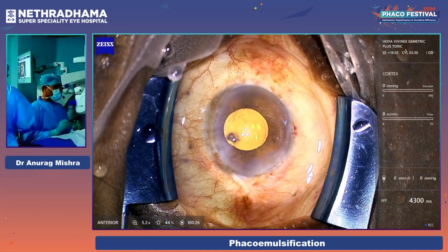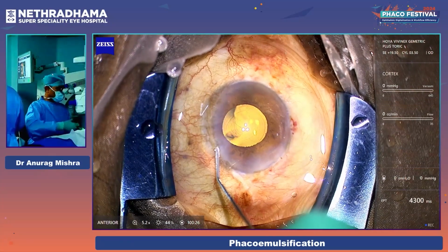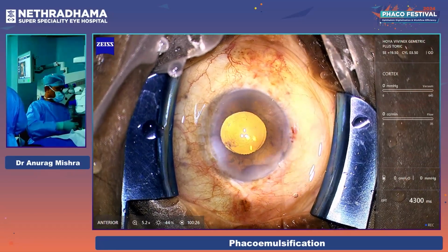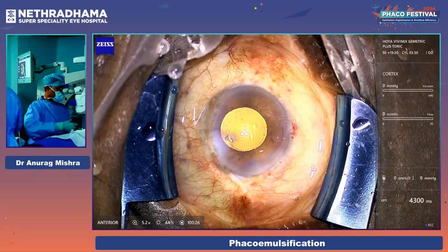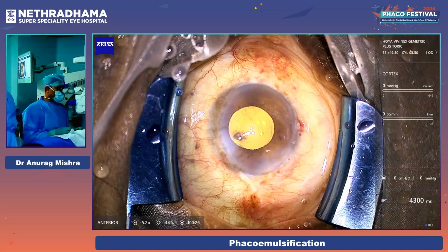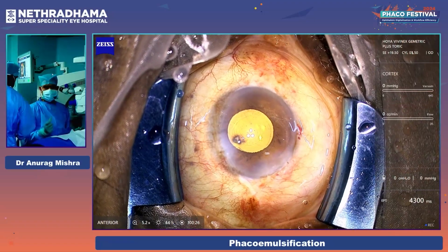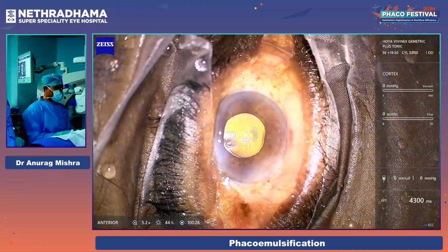So, this has many features. We saw the implantation system. We have already heard about the material being very good. The textured haptics impart incredible rotational stability to the IOL. And the other factor that is worth a discussion is the light distribution that varies according to the pupillary size. So, moxifloxacin, do you have it? No, okay, fine. So that concludes the case here. We'll just remove the speculum and let the patient go.